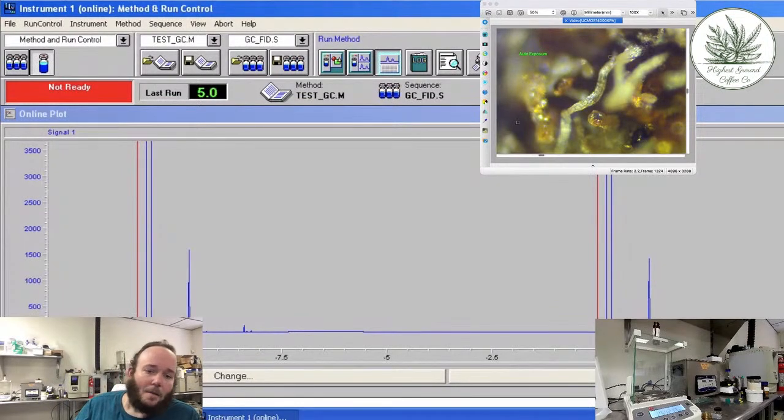But my suspicion is when we get to quantifying the data, that the calibrations, especially around the 10x dilutions, are probably wrong, because this felt like it was wrong. And the solution to that is to redo the calibrations and also use a more appropriate pipette. I do have one that on the top end is 10 microliters and is like 0.1 microliter on the low end.